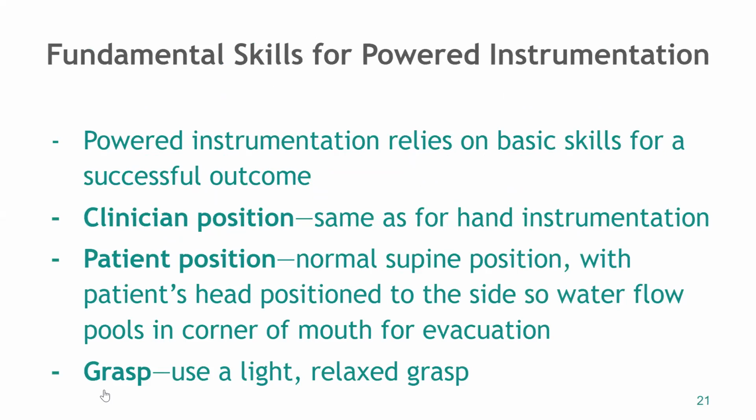So it's important that we have the basic skills to be successful with power instrumentation. Our position is going to be the same as for hand instrumentation. Patient position is also going to be the same. It's a little bit easier if their head is turned to one side or the other so that the water can pool in the corner of their mouth. It's just easier for you to get it rather than having to put your suction directly down the middle of their throat and gag them.